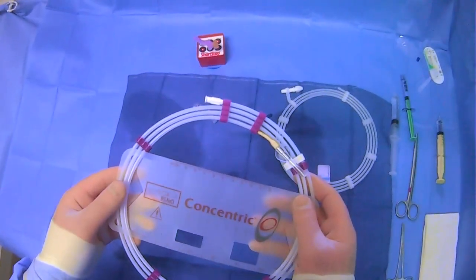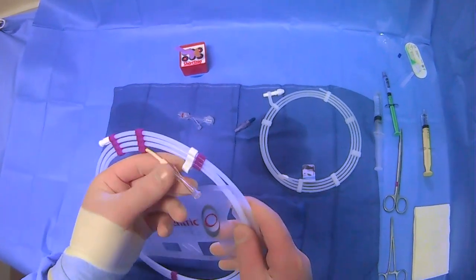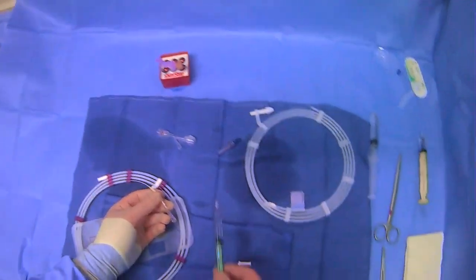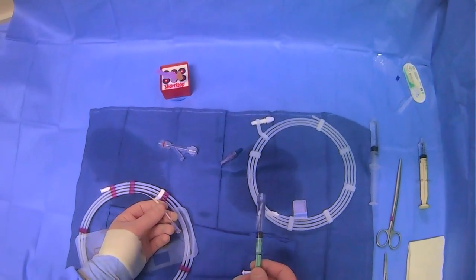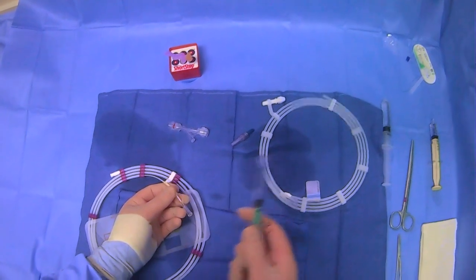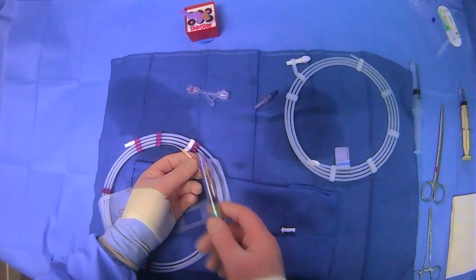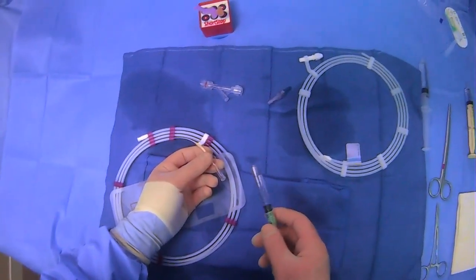This particular catheter we have here is a microcatheter, and essentially what we're going to do is discuss how we're going to prepare things. We also have a microwire — not necessarily the exact wire we would use with this catheter, but it's what I have on hand to demonstrate the principles. With a microcatheter, it's important to realize that you can't use a traditional syringe to flush.